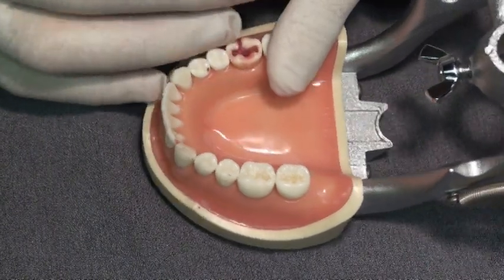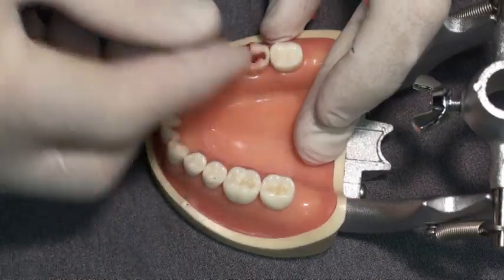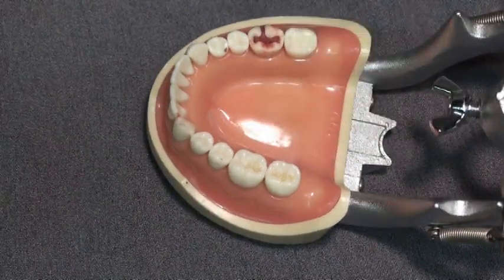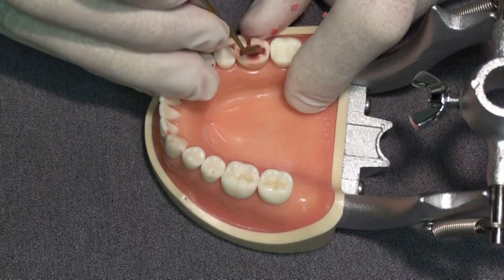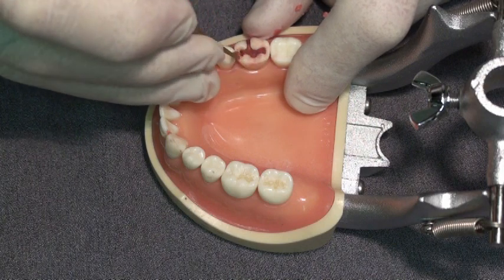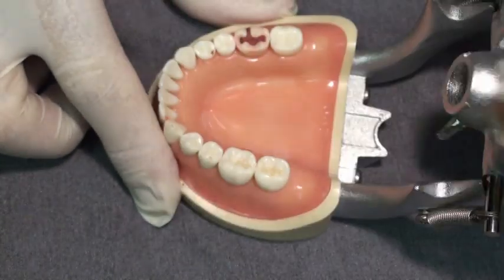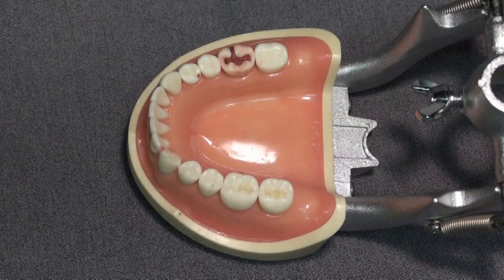So we're not losing any chair time. You'll see how we use this very smooth surface created with red border molding wax — using the gloved finger to actually smooth this surface and create a surface that is much smoother than you can get by forming composite with an instrument. We've smoothed the wax and scraped away the excess. Now we're going to take into account the opposing occlusion, so I'm going to have the patient bite together. They can go through excursions. We now have a surface that is very smooth and needs minimal or no polishing if we can reproduce this surface in composite.